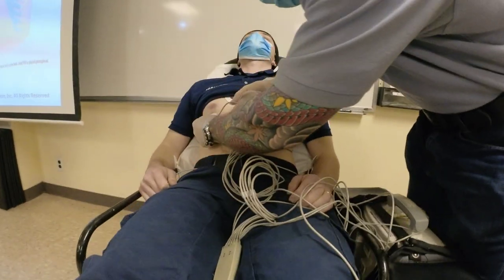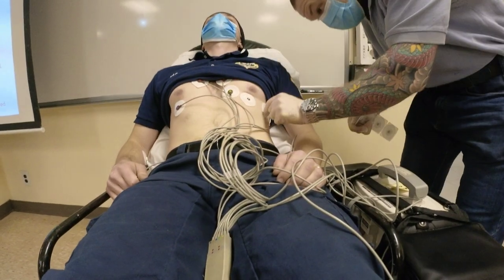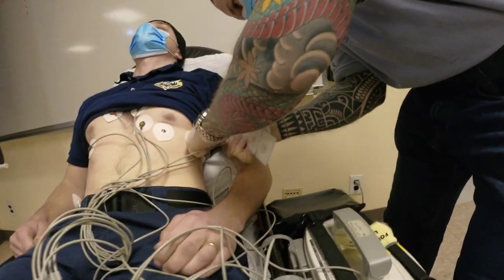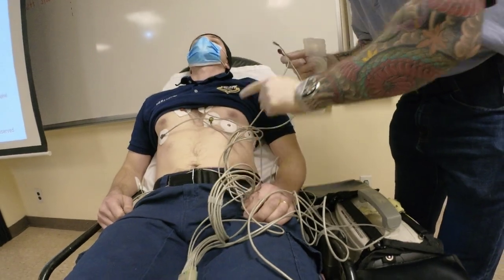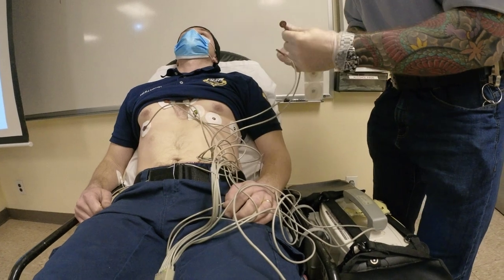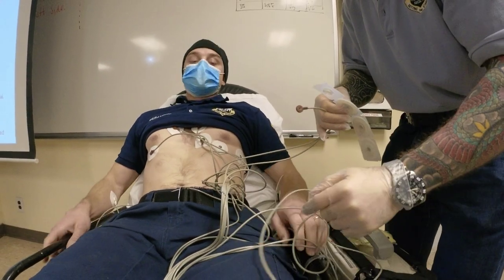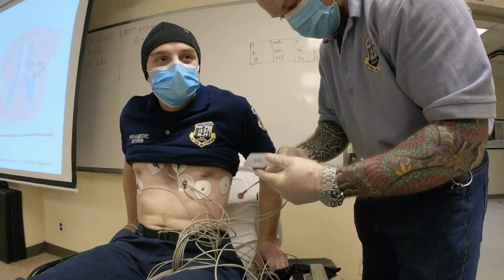And then I take my V5 and I take my V6, where are these gonna go? In the back, right? Can you grab the rails and scooch up a little bit? That's good. That's good.